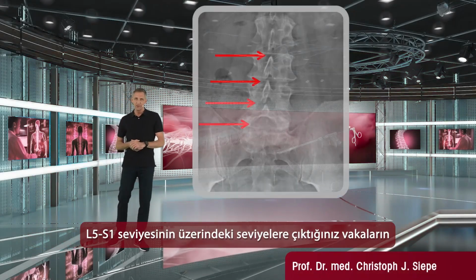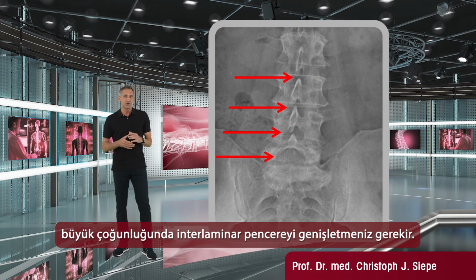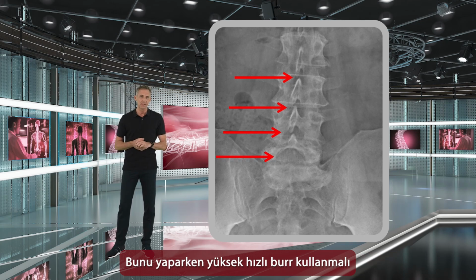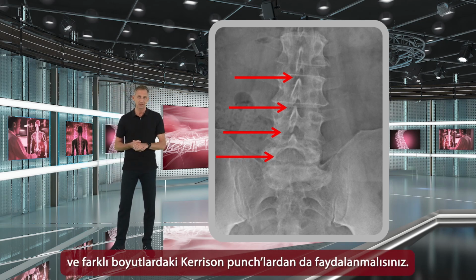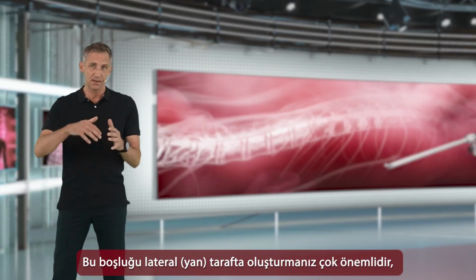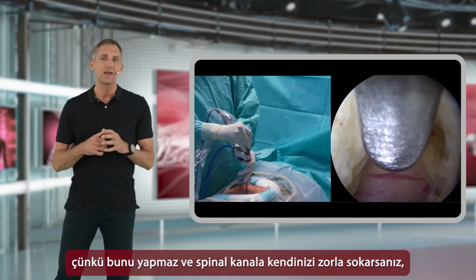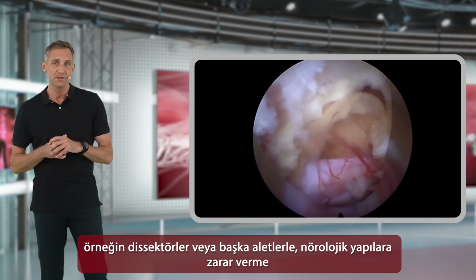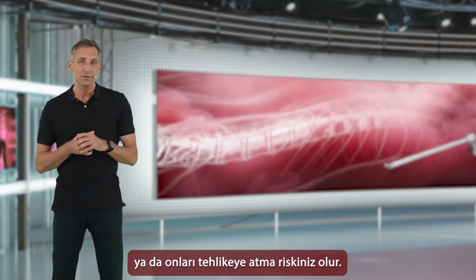In the vast majority of cases, when you go to the levels above L5S1, then you will have to widen the interlaminar window, and you need to do so by using the high-speed burr and also by using varying sizes of Kerrison punches. It's very important that you create this space laterally, because if you don't do so, and basically if you force your way into the spinal canal, for example, with dissectors or with any other instruments, then you will run a risk of compromising or even injuring the neurostructures.